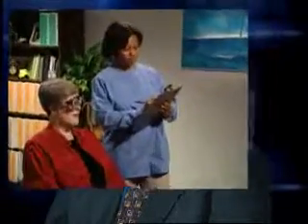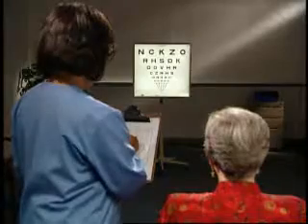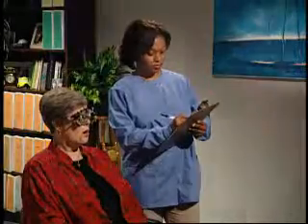anything else that would allow them to gain some visual advantage while reading the chart. C, S, O, K. Miss Burt, please sit up straight. Thank you. You may continue. N, C, K, D, N. Examiners must refrain from pointing to a specific letter or line on the chart.